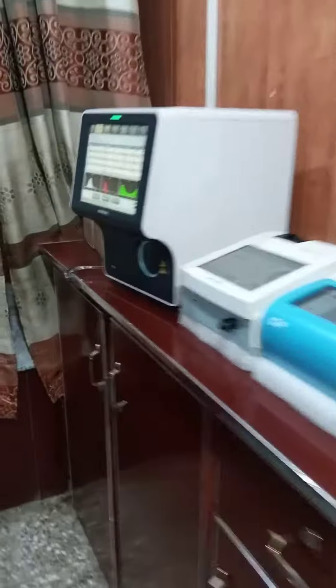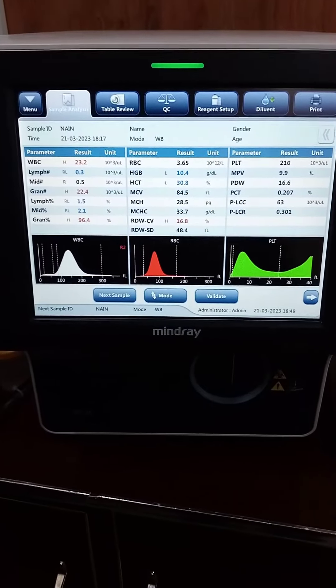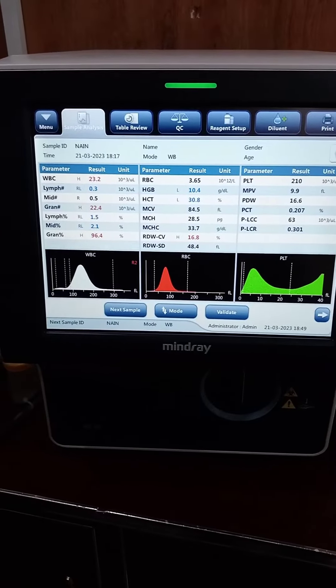First of all, this is a hematology analyzer from Mindray company. A complete blood count is performed in this machine — white blood cells, red blood cells, platelets, and all the blood parameters are checked by this machine.